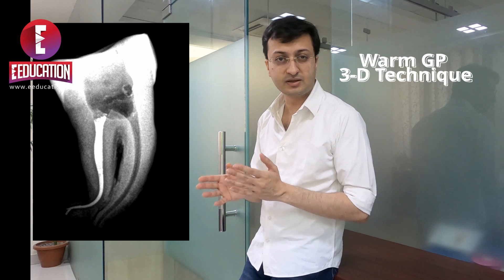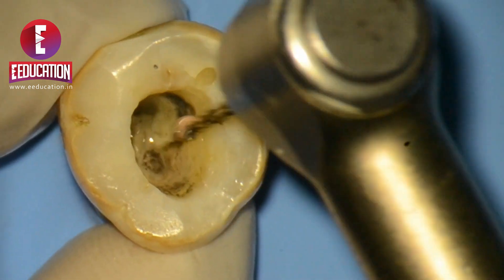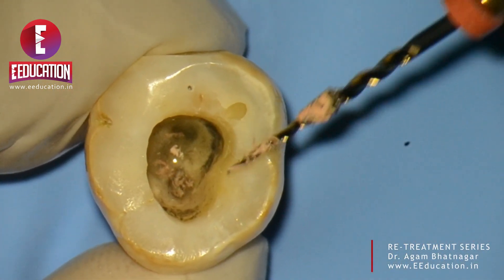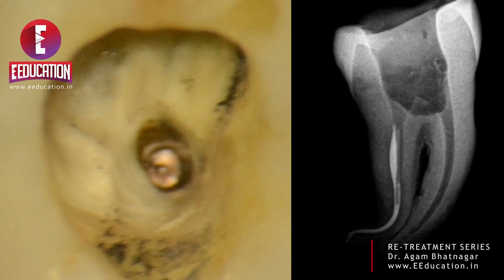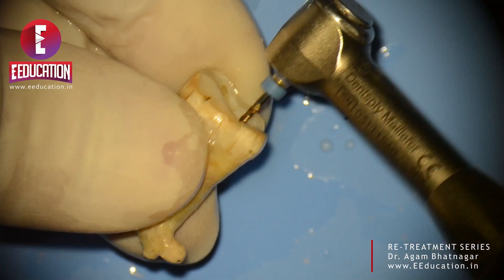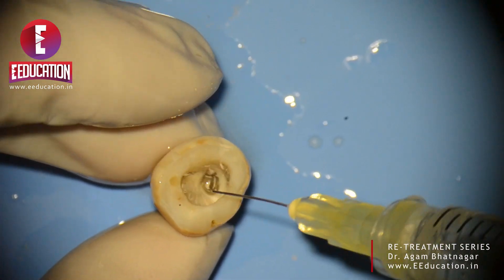We tried this file in a couple of other situations and every single time it gave reproducible results — like this particular tooth with a strong curvature, obturated using a warm gutta percha technique about a year ago. That's the coronal flare instrument creating the pilot hole, used just a few millimeters below the orifice to give passageway for the HyFlex Remover to enter. Gutta percha comes out in flakes. Copious irrigation removes any debris, and the IOPA shows the space between the gutta percha and the canal wall into which the HyFlex Remover will be inserted in short in-and-out strokes.